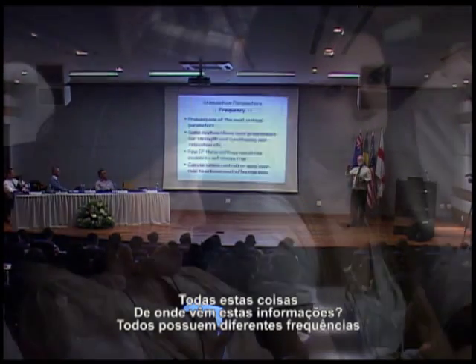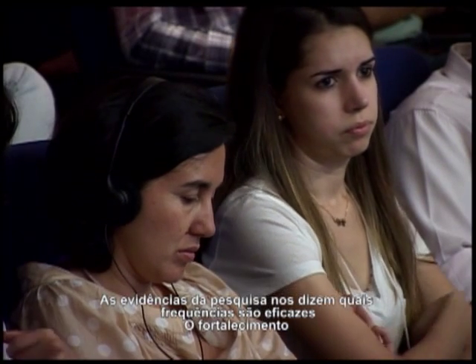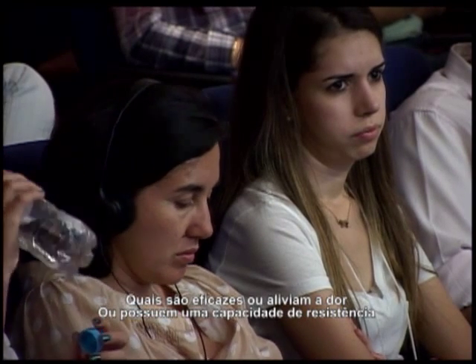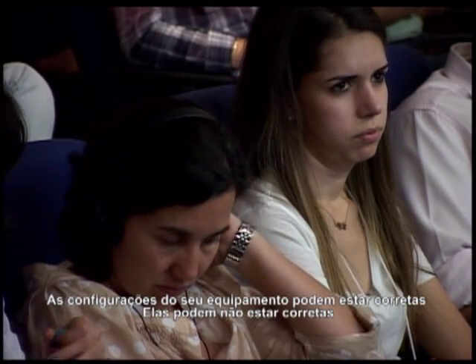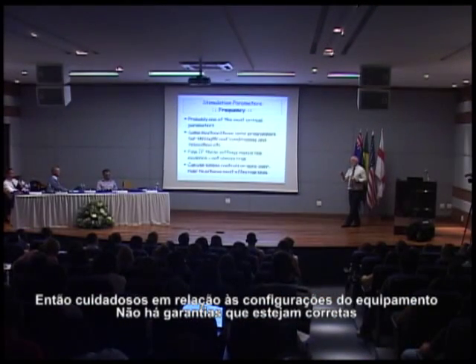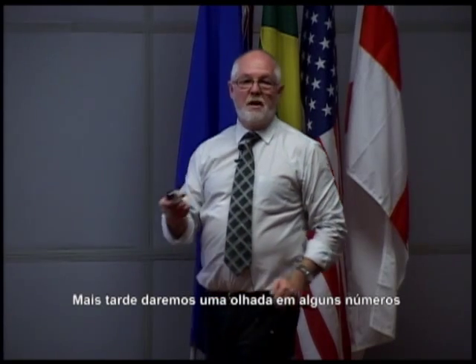They all have different frequencies. The research evidence tells us which frequencies are effective for strengthening, which frequencies are effective for pain relief or for endurance capacity. The settings on your machine may be correct, they may not be correct, so be very careful with the automatic settings on machines, because they're not guaranteed to be correct. We'll look at some numbers later on.